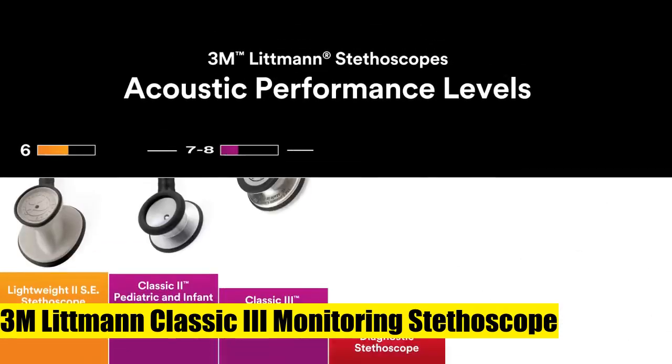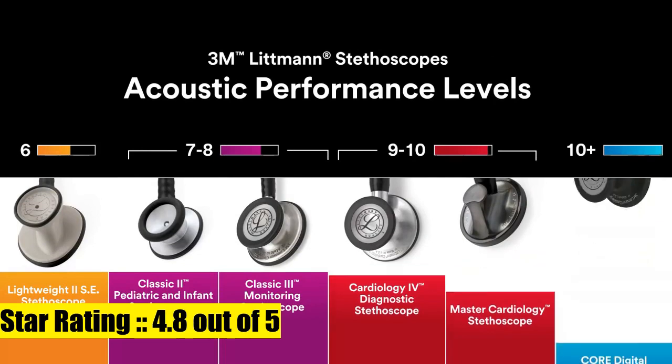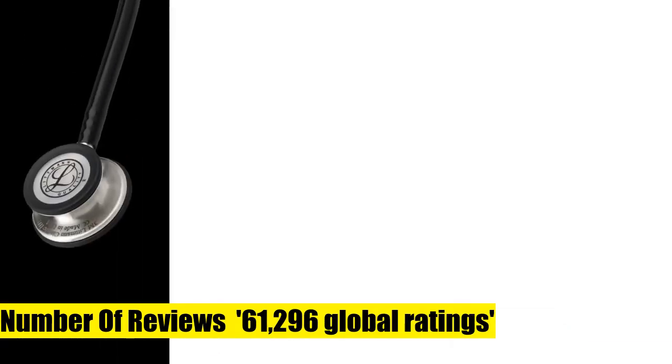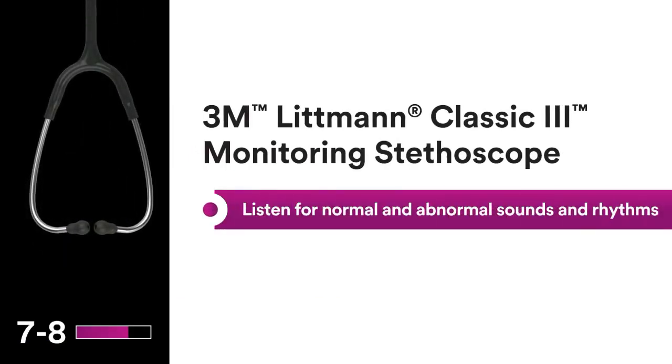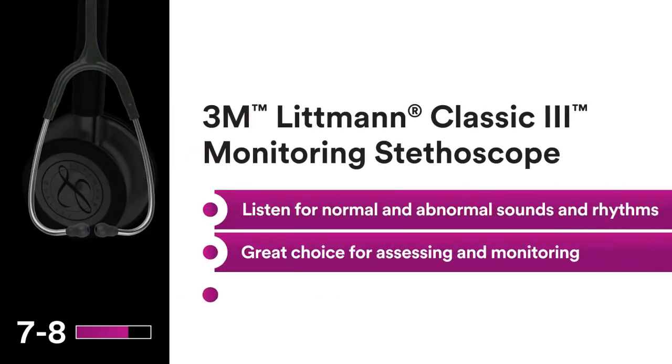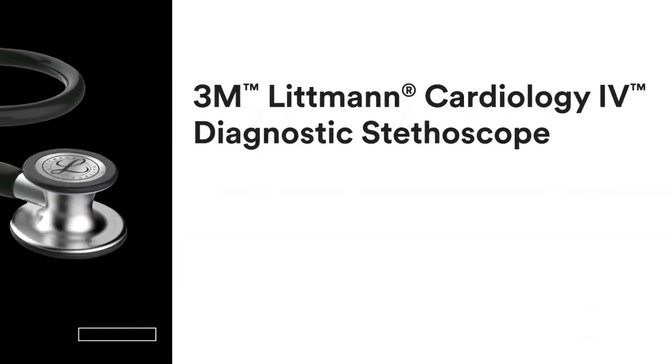3M Littmann Classic 3 Monitoring Stethoscope, Rainbow Finish Chestpiece, Black Stem and Headset. Monitor and assess a wide range of patients; detect normal and abnormal sounds and rhythms. Useful in non-critical care environments such as a medical office, general ward, OB-GYN, ambulatory clinic, or urgent care.